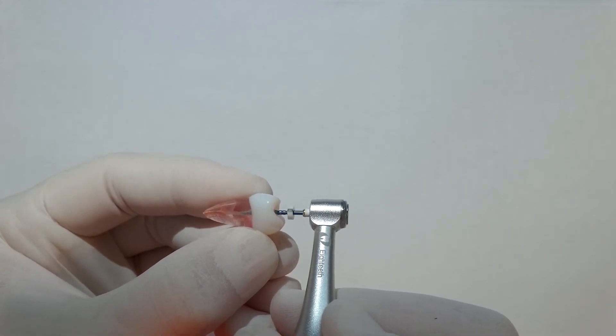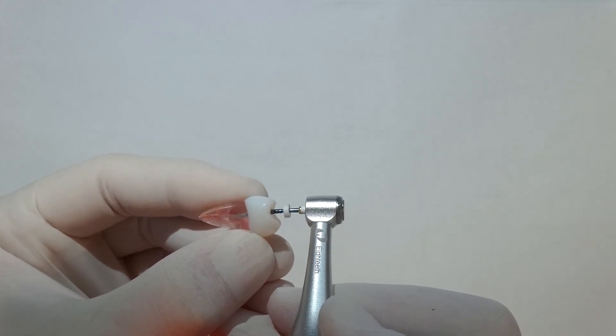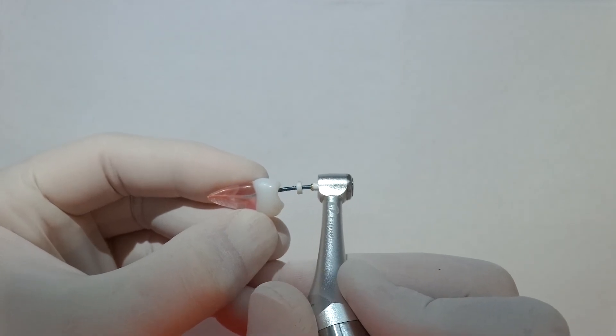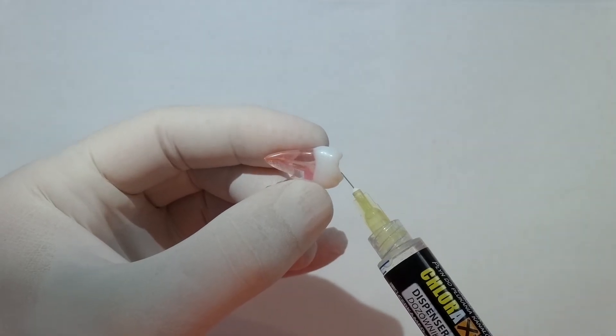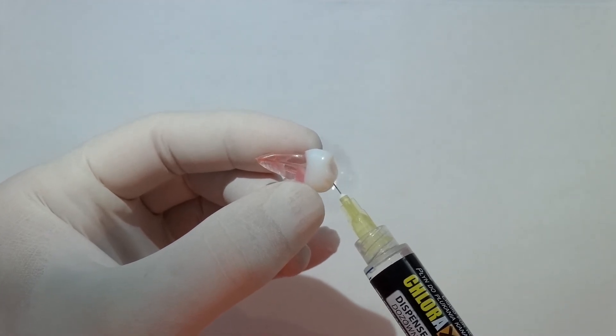You'll notice the files, because of the heat treatment, they'll keep a certain degree of flexibility, so they sometimes come out a little bit bent. That's perfectly normal for this type of alloying. Again, back in with the irrigation, and we'll make sure it's still patent, still really nicely patent.